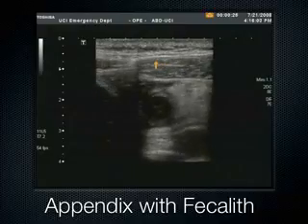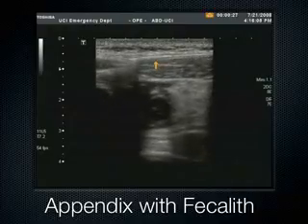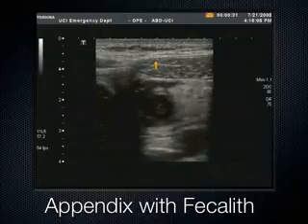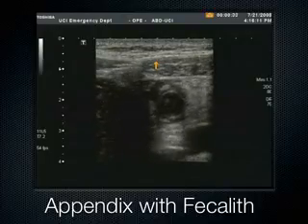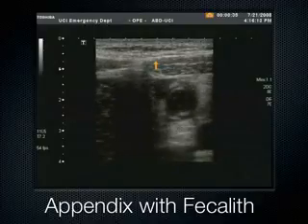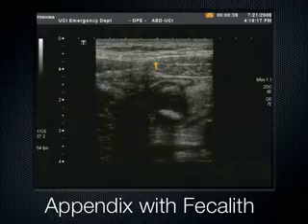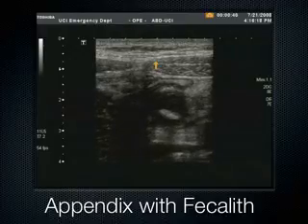Here is one last example of another patient with appendicitis. We can see here, this is the abdominal wall musculature. Again, this theme keeps coming up over and over again. Here's psoas somewhere down here, smushing this appendix between the two muscle structures. I think psoas is actually over here too. I see it over here. And this one's got a little fecalith right there. You see that? Which literally means poop stone. That's inside the appendix.